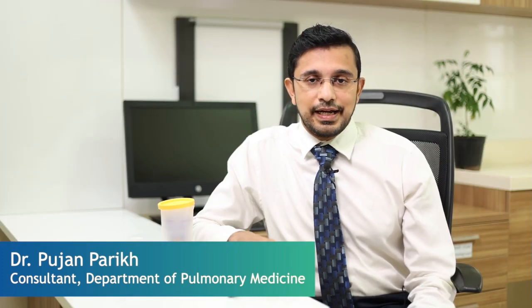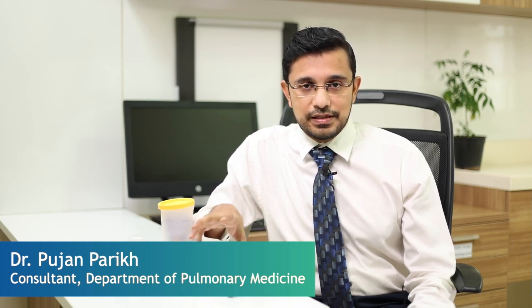The only disadvantage is that the patient has to take it properly, otherwise the medicine will not be properly delivered into the lungs and will not have an effect. So basically, inhaler therapy is a method of drug delivery directly into the lungs. Inhaled therapy can be delivered in three ways. One is MDI, second is DPI, and the third is nebulization.